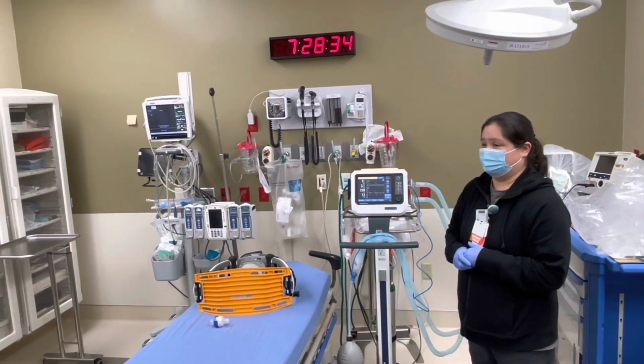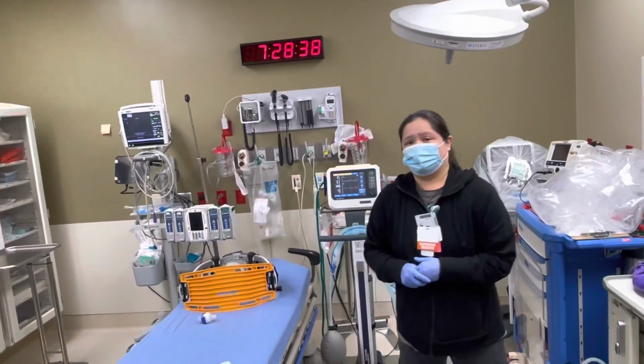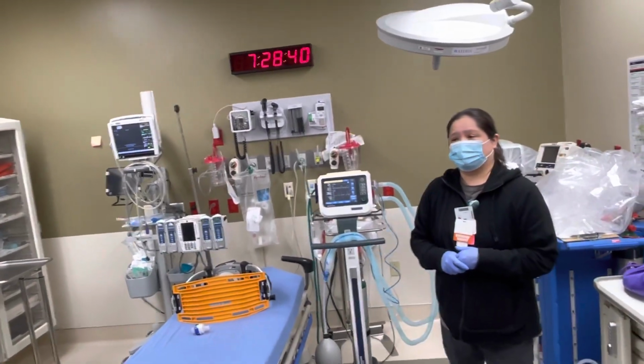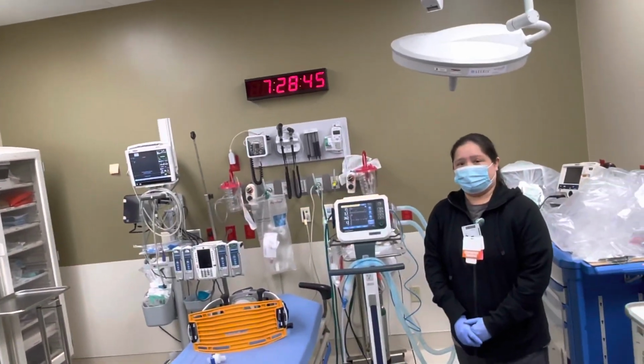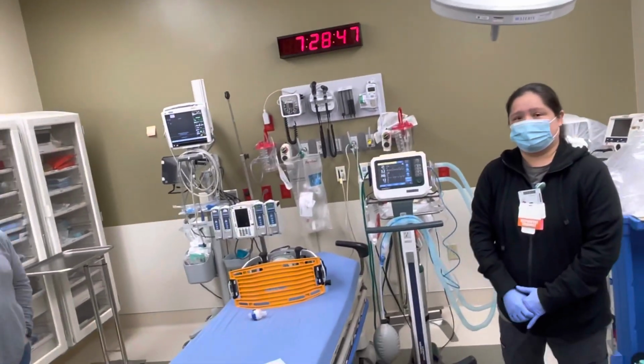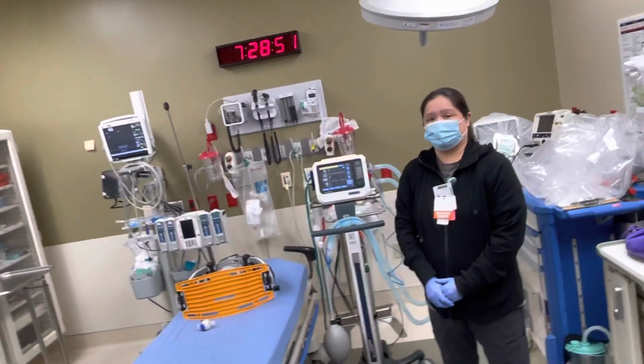I've had issues with specific doctors where the vent would not stop alarming, no matter what I did. The doctor was frustrated because we couldn't fix the alarms, and it turned out the tube wasn't in the correct position. Once the x-ray was done, they adjusted it, and all the alarms stopped.